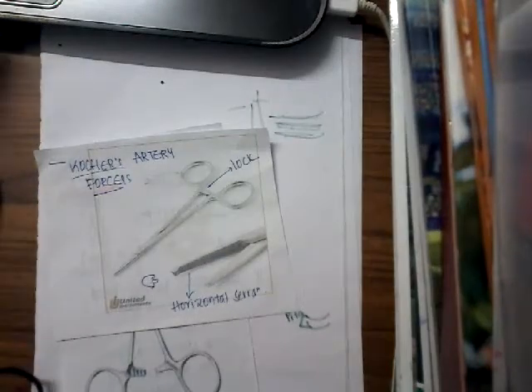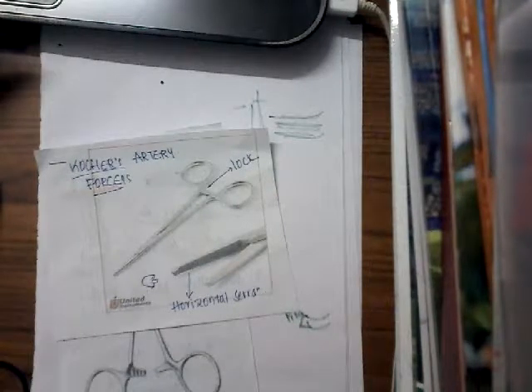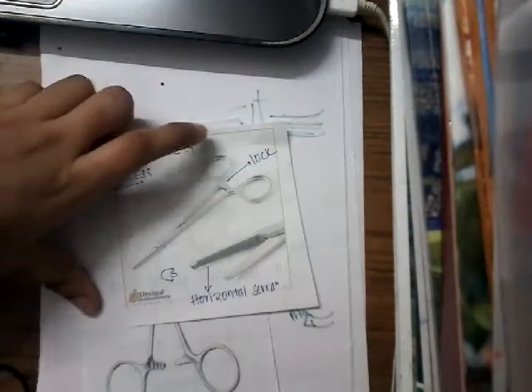Hello friends, welcome to a new lecture today. I would like to discuss about Kocher's artery forceps. So how are you going to identify this Kocher's artery forceps?